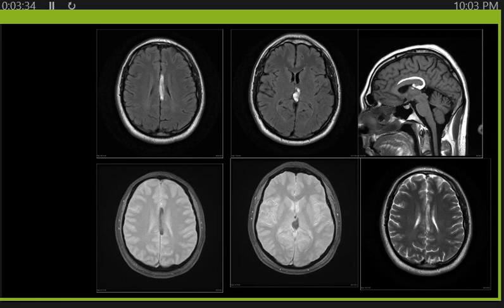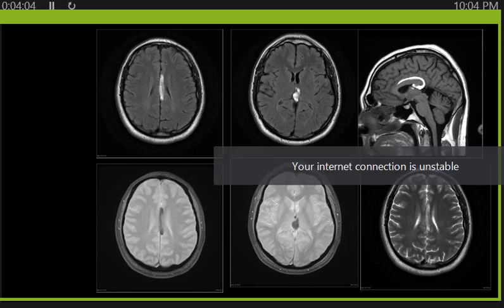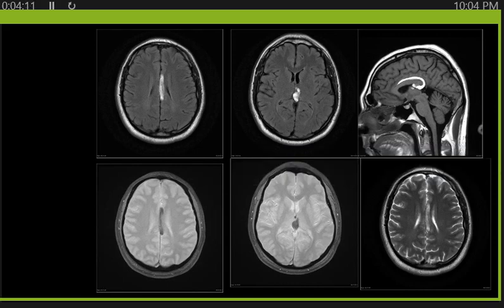How many types of pericallosal lipoma do you know, radiologically I mean? Two types. Very good. What are the two types? Tubulonodular and curvilinear. Very good. We have two types, tubulonodular and curvilinear.